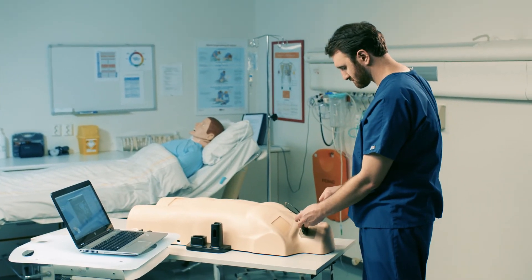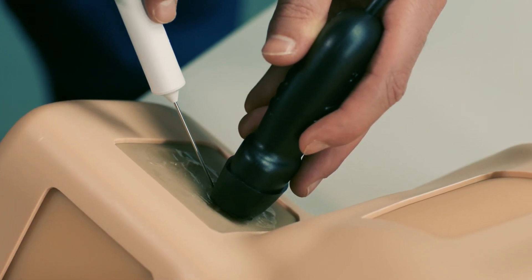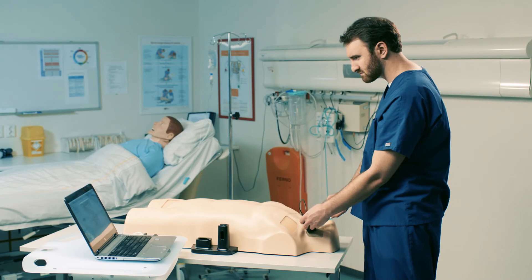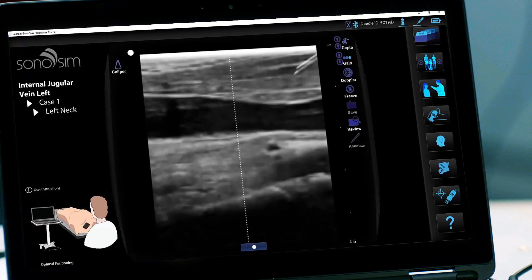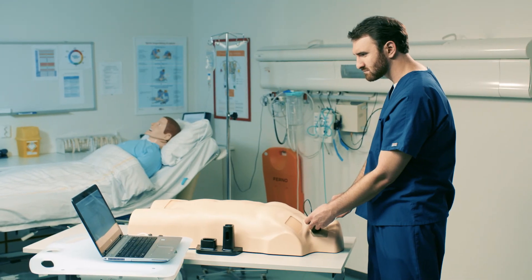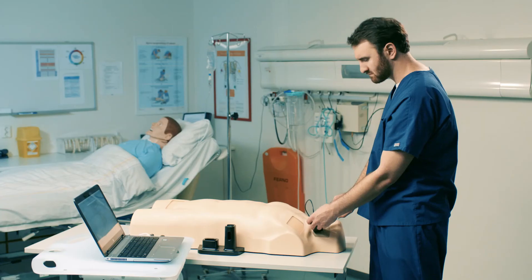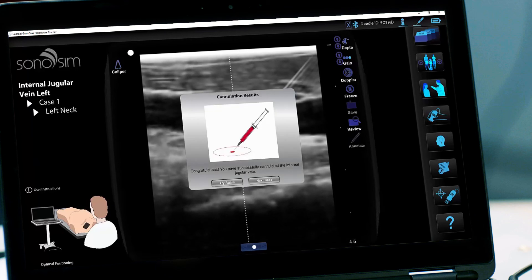Place the needle and syringe on the trackpad and orient it as desired, then advance the needle. You will be able to track the needle's progress on the ultrasound screen. The needle must advance slightly before it will be visible on the screen. The needle icon will display blue when insertion is detected. When ready, pull back on the plunger to aspirate. You will be given instant feedback on the result of the procedure and the option to try the case again or to proceed to the next case.